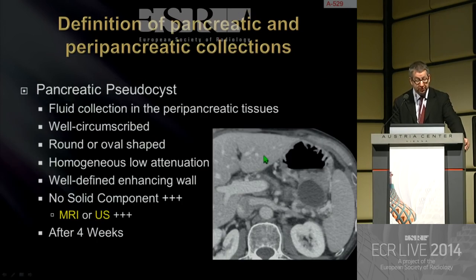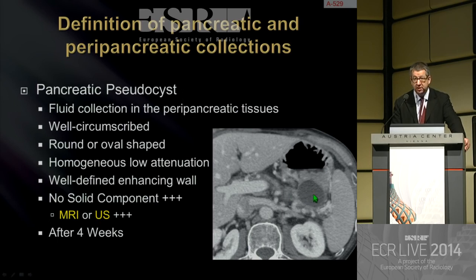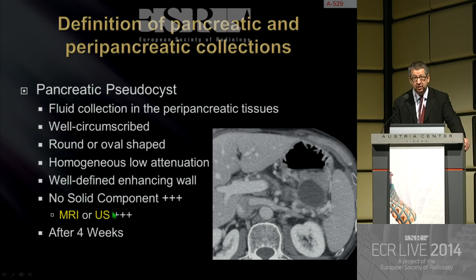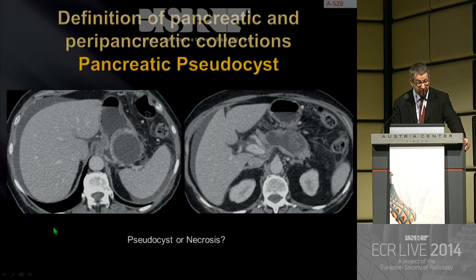Pancreatic pseudocysts are defined as fluid collections in the peripancreatic tissues with a well-circumscribed appearance. They are round or oval-shaped with homogeneous low attenuation and a well-defined enhancing wall. There is no solid component. CT is not the best examination to confirm the absence of solid component; MRI or ultrasound are by far much more accurate in detecting solid components in a fluid-like collection at CT. The term pancreatic pseudocyst should be used only after four weeks of evolution.